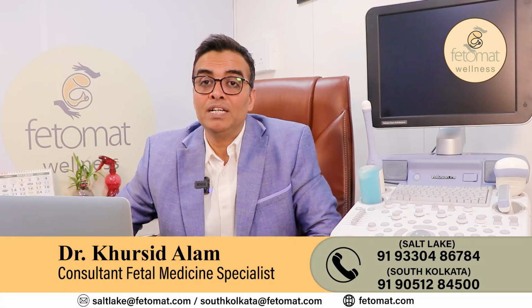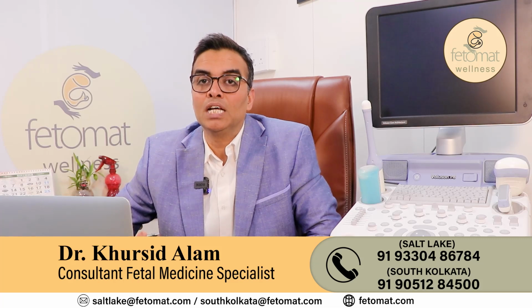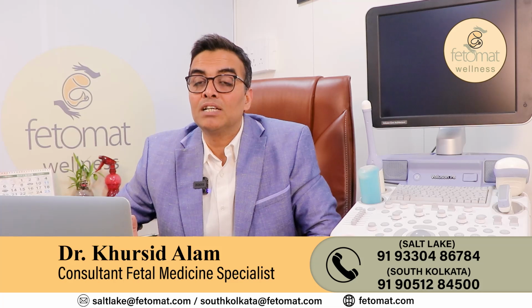Once we have done saline infusion sonohysterography, the other thing is to check on the tubal patency, because as I have told you, tubal factors contribute to 35% of female infertility. So how do we check on the tubal patency? Because many times we come across a situation when after scanning, she asks whether my tubes are open or not.